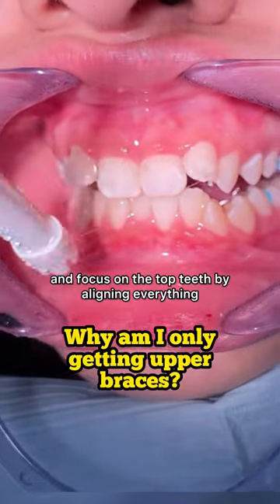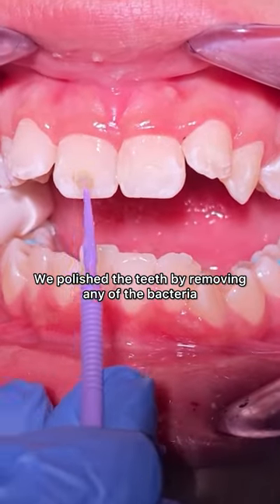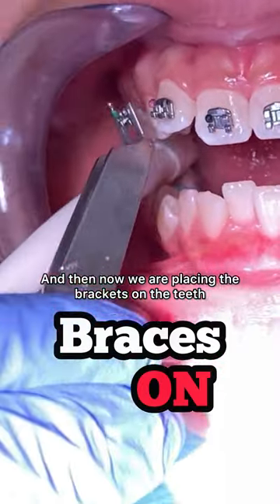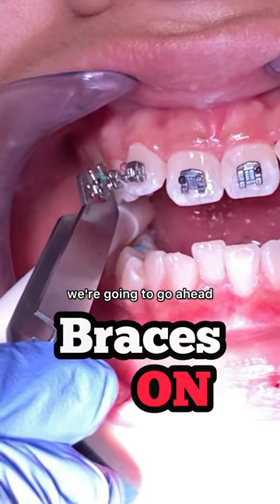As you can see here, we polish the teeth by removing any of the bacteria. We then etch, rinsing the etch, followed by bonding the teeth, and now we are placing the brackets on the teeth.